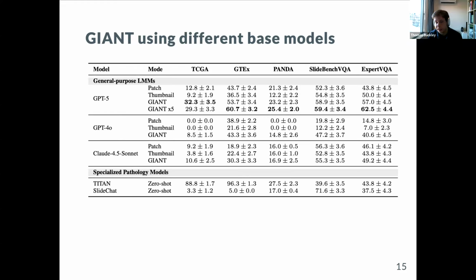If you ask it anything unlike that, even if you give it five options instead of four, it kind of breaks down. I was probably just fine-tuned on just one type of prompt or something. Yeah, they only fine-tuned it on these four option multiple choice questions. And we didn't really want to do any further fine-tuning in this paper because the point was, can you use a generalist model without any fine-tuning?